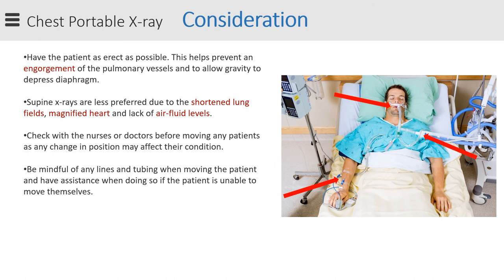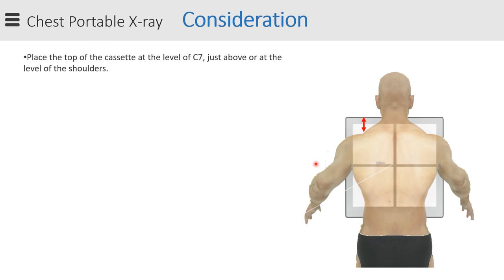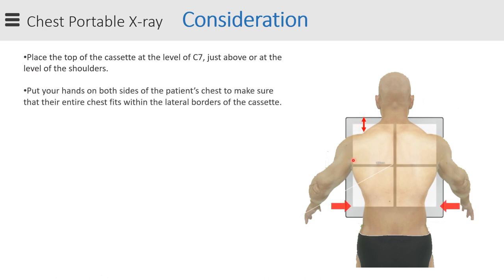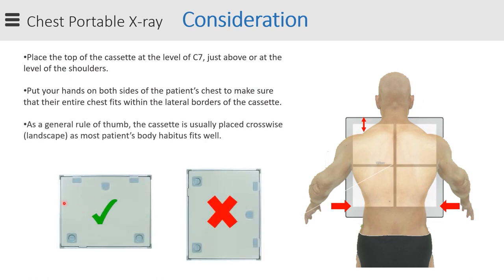Have assistance when moving patients if they are unable to move by themselves. One of the challenges in portable chest x-ray is positioning the cassette. To ensure you are including the apex of the lungs, the superior border of the cassette should be at the level of C7, just above or at the level of the shoulders. Place your hands on both sides of the patient's chest to confirm the entire chest fits within the lateral borders of the cassette. As a general rule, the cassette is usually placed crosswise or landscape, as most patients' body habitus fits well this way.